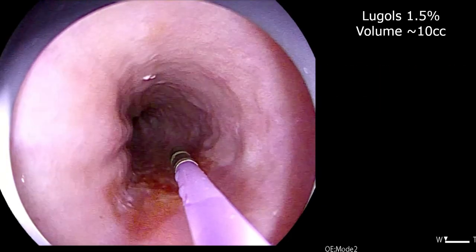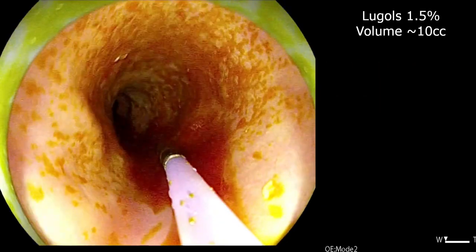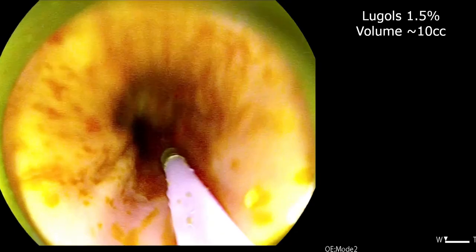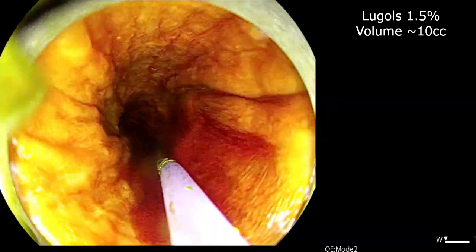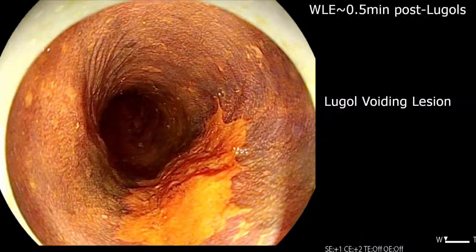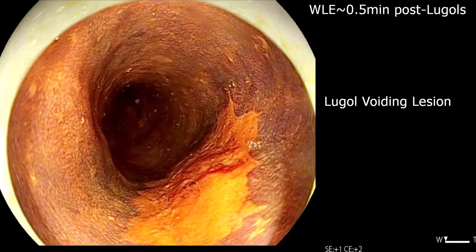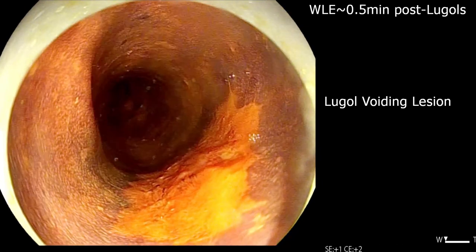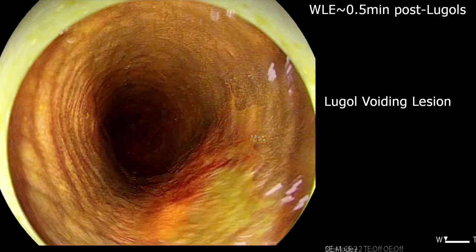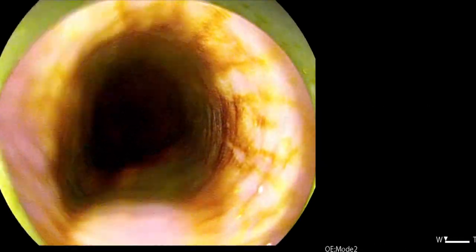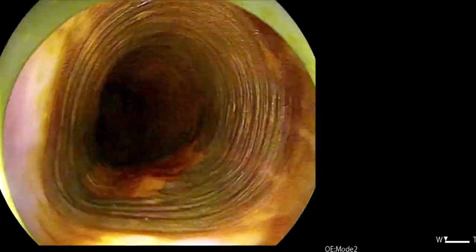A 1.5% Lugol solution is then instilled using a spray catheter. With white light, after about 30 seconds, the lesion shows up as a Lugol voiding lesion, which is indicative of squamous dysplasia.